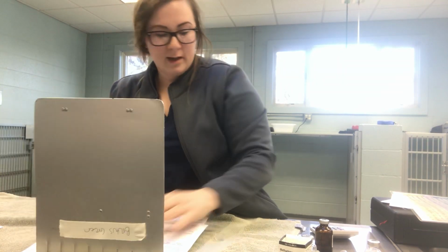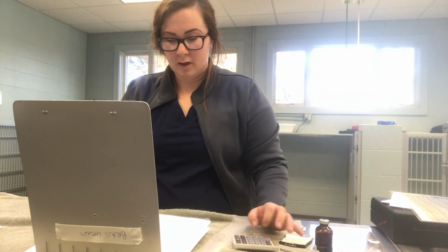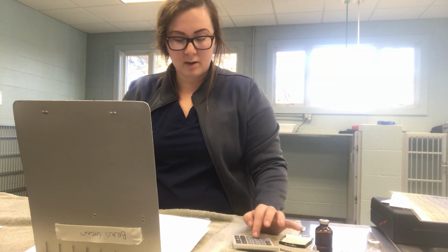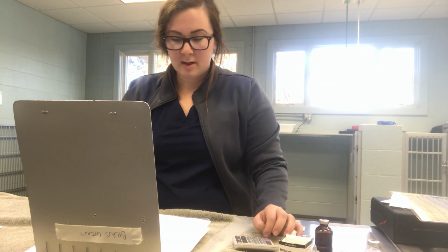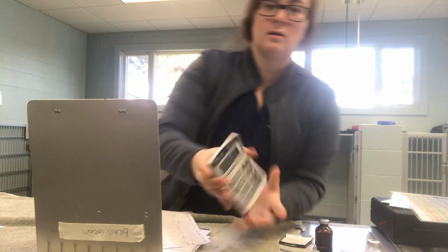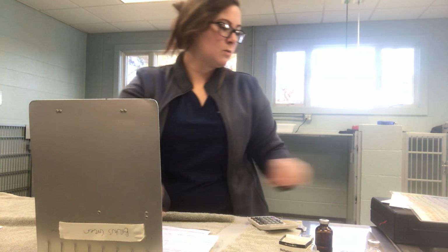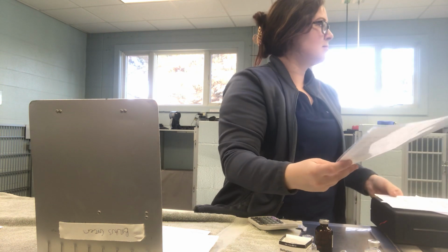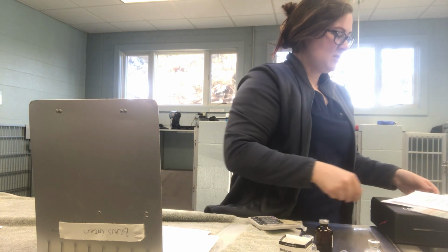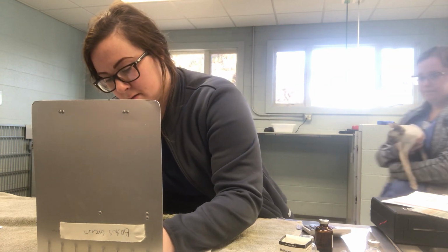So we are going to calculate our fluid rate, which is going to be 3 mLs per kg an hour. So 2.2 times 3 is going to give us a rate of 6.6, which we have here on our chart. See, 6.6. All right, so we should be ready for our patient. Just going to bring her over. We're going to be giving this sub-Q. So I'm just going to write sub-Q on my chart.